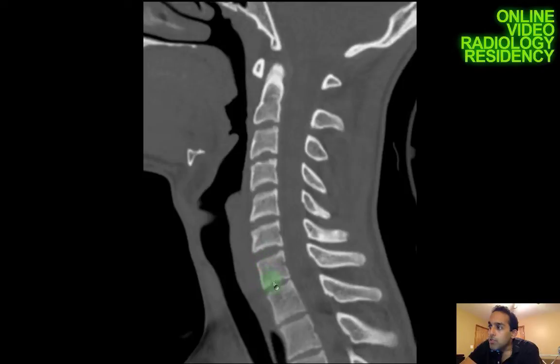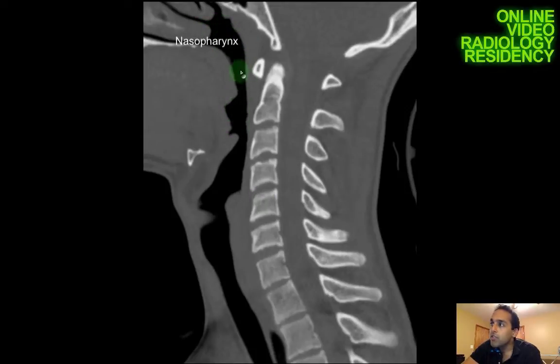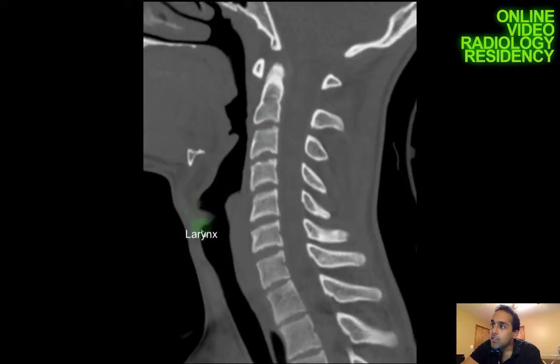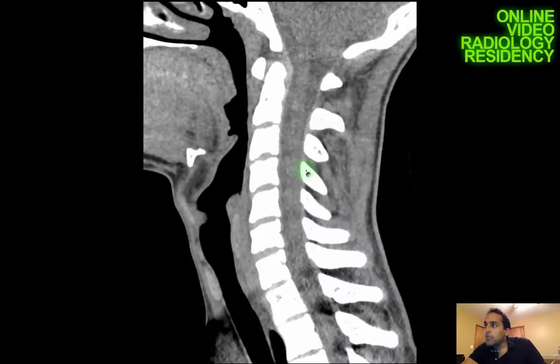If one level is abnormally widened relative to the rest, that can be indicative of a traumatic injury or possibly an occult fracture at that level. I'm also looking at the pre-cervical soft tissues — the nasopharynx, oropharynx, and retropharyngeal soft tissues. These should be only 8 millimeters thick up to the C4 level. Below that, the pharynx splits into the airway anteriorly and the esophagus, and at that level you can get up to 22 millimeters of thickness. I've measured these and they are normal.